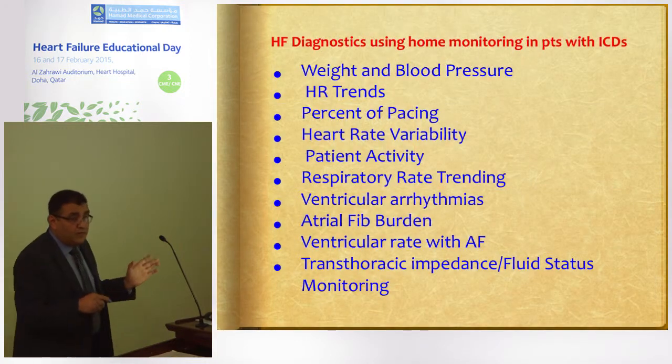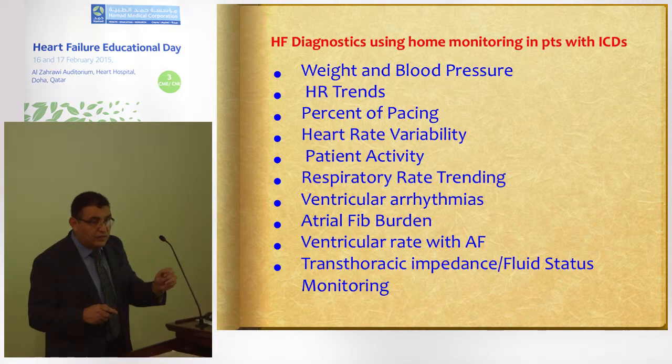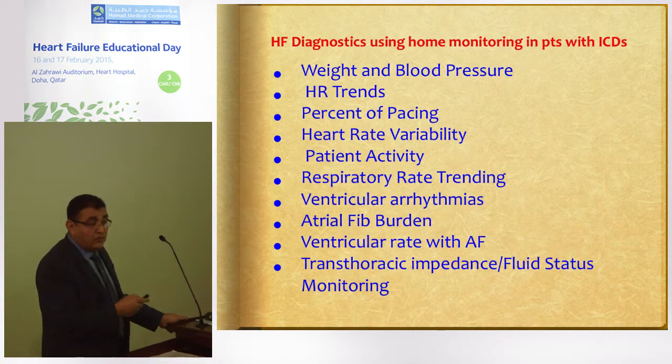So let's switch gears now. We talked about prevention of sudden death by defibrillation. Our new devices now have more sophisticated parts in heart failure management and monitoring. At our center, we have at least 10 patients for whom we do home monitoring.